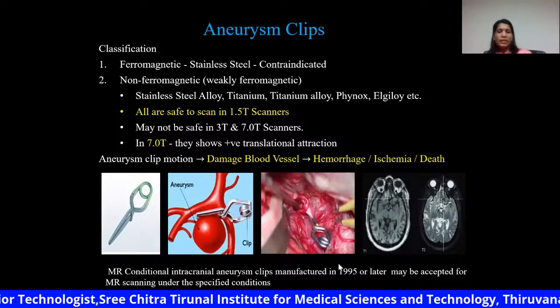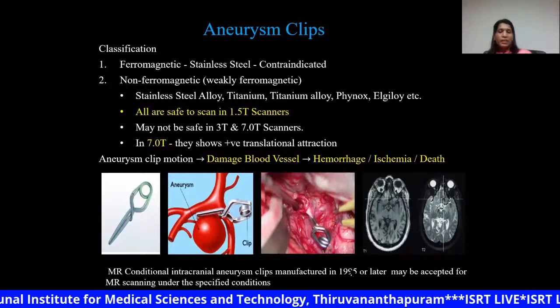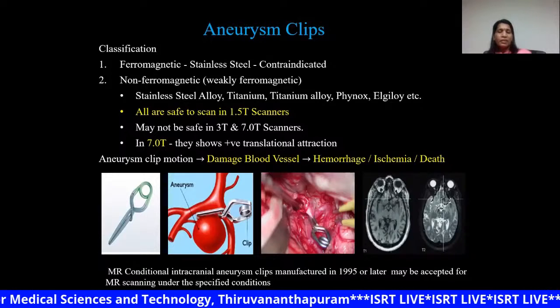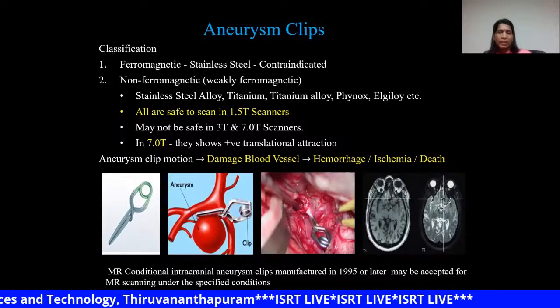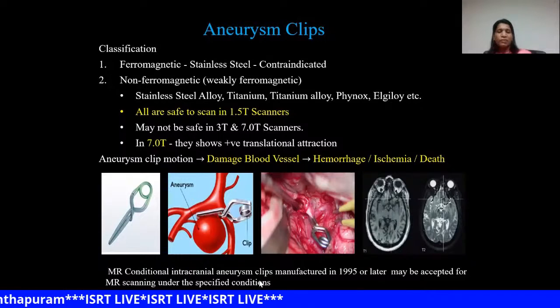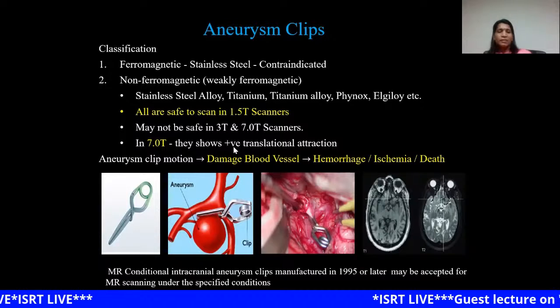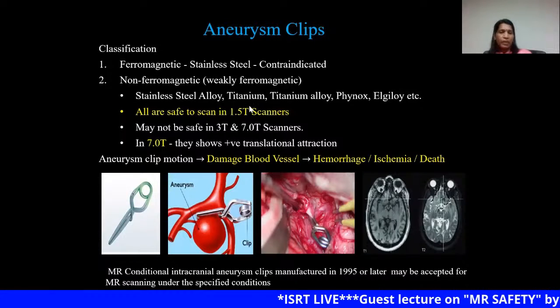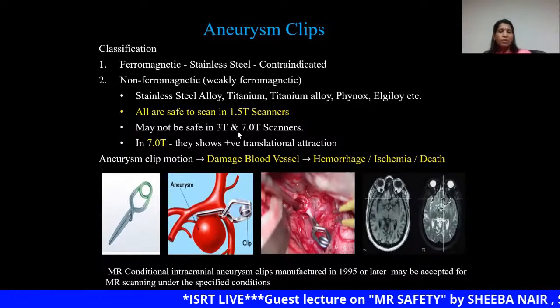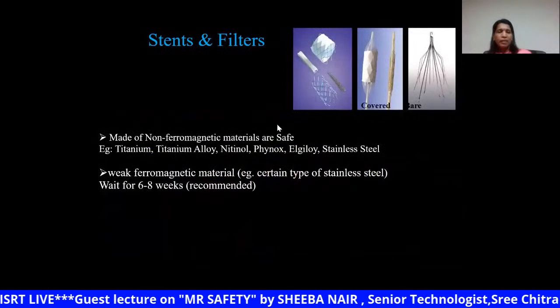But for clips manufactured after 1995, they have been tested for MR safety, and if the manufacturer says it is safe under specific conditions, such clips we can scan at 1.5 Tesla, and these may not be safe at a 3T or 7 Tesla system.